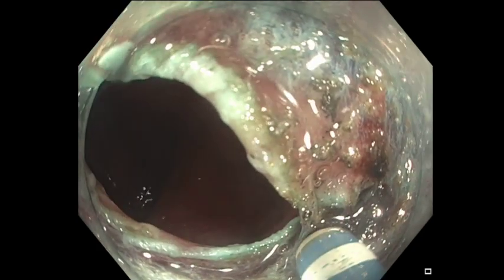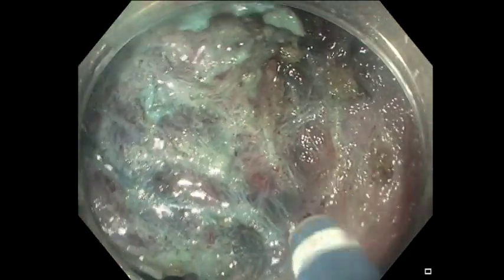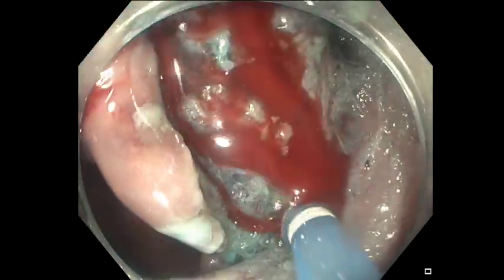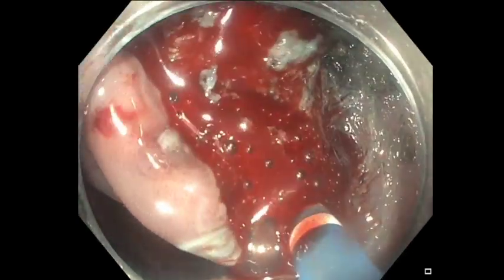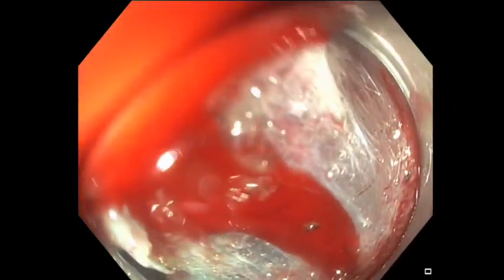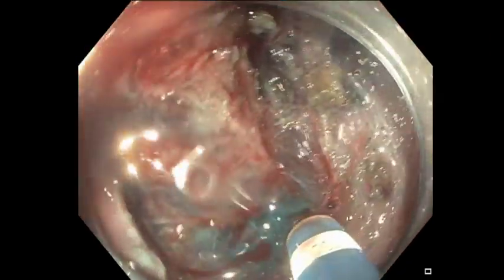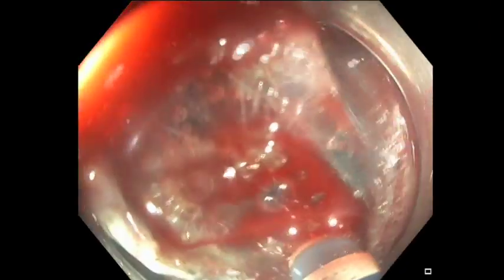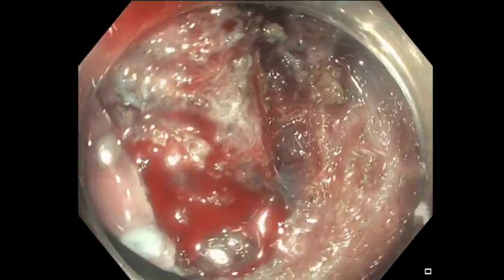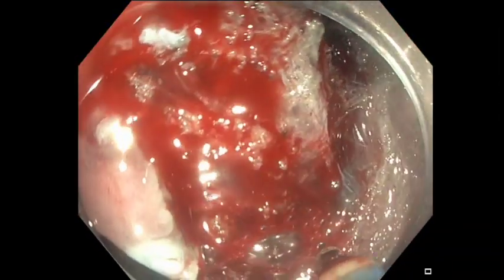So you can see here, the more we dissect the left side, the more the lesion is retracting to the right side. And I will just continue to dissect. This is an example of when bleeding can happen. Sometimes a knife could be enough, but you would notice here, although there is bleeding, I will inject, and this injection will cause tamponade, and dissect further to expose the blood vessel, because if I try to coagulate it and I don't have enough space, you may not be able to coagulate and it may cause problems.